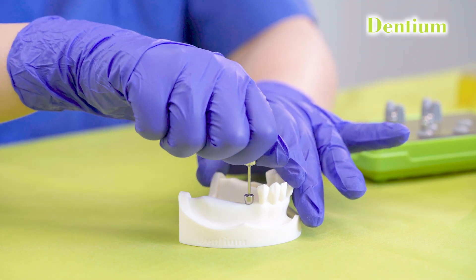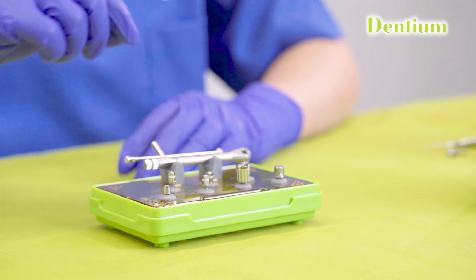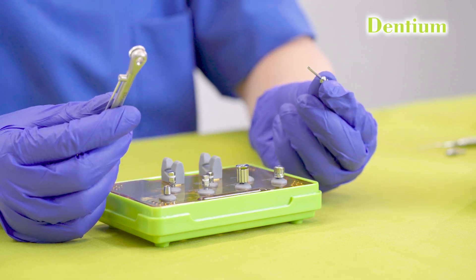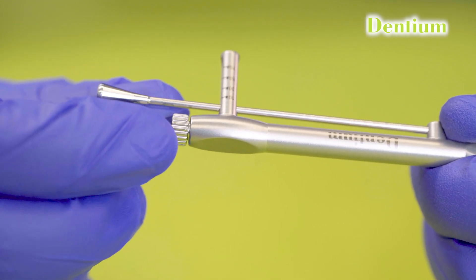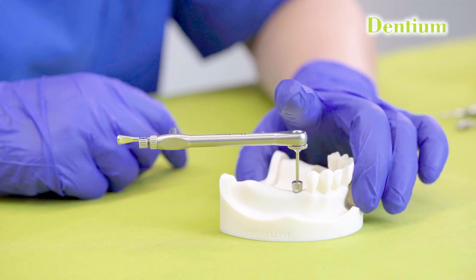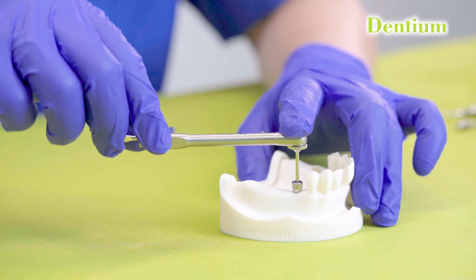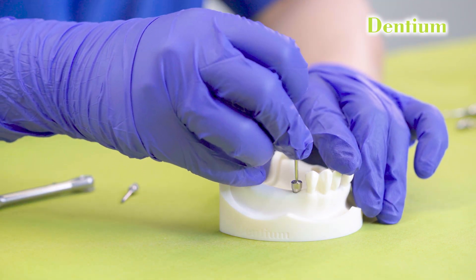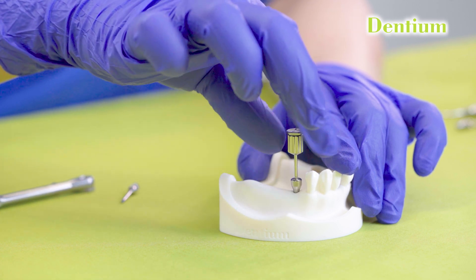In some situations, it is difficult to unscrew the healing abutment by hand. In those cases, a torque ratchet and a torque ratchet driven hex driver are used. The torque ratchet is adjusted by orienting the arrow facing away from the torque. Insert the driver into the healing abutment. One hand is used to stabilize the wrench and the other hand is used to rotate. Unscrew the healing abutment once you feel it has begun to rotate, then unscrew the rest with the hand driver.